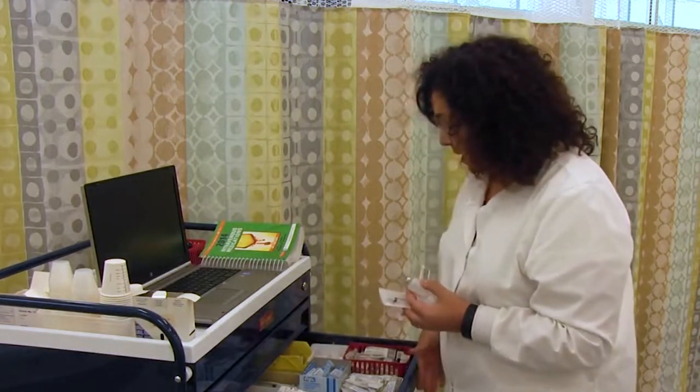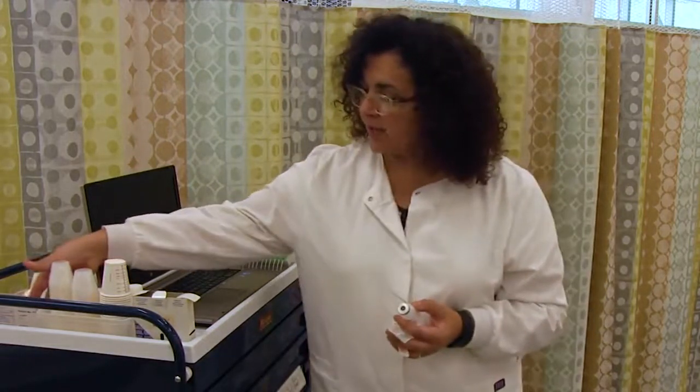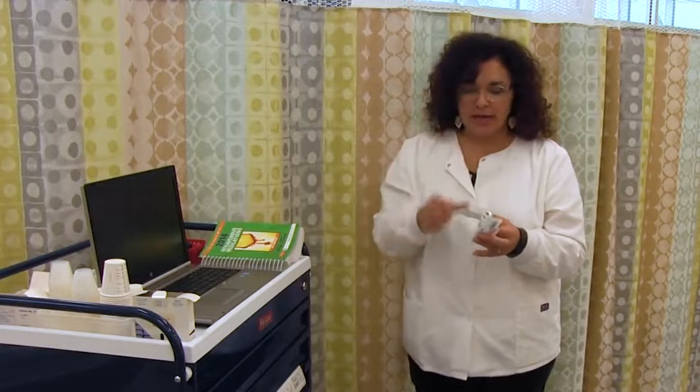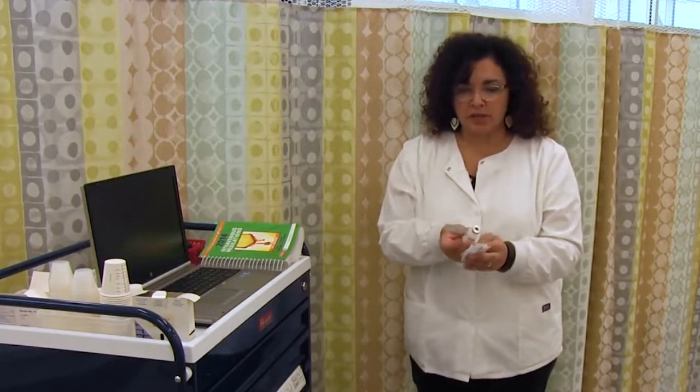I have alcohol pads in my pocket. If I needed tape for labeling, I could grab some tape. But in this instance, because I only have one injection, it is okay to use the vial as a means of labeling the syringe. If I had two look-alike syringes, then I would have to label them.